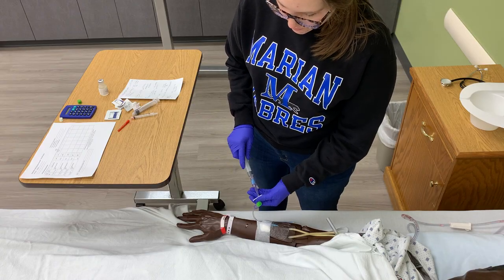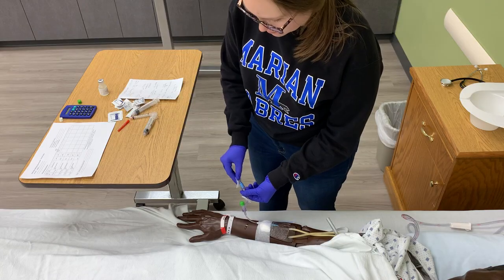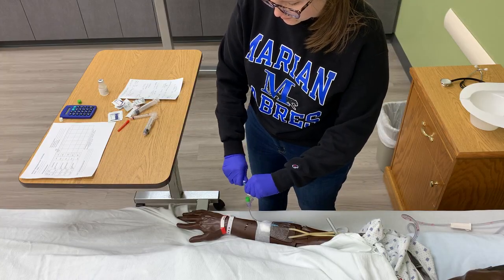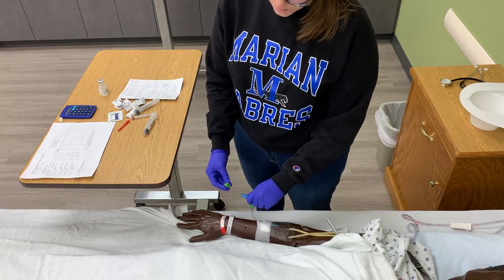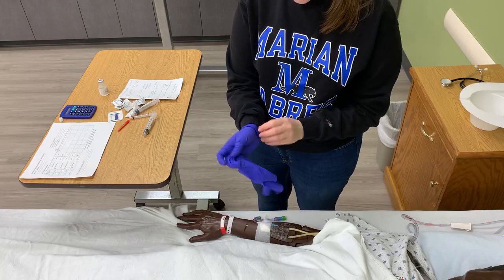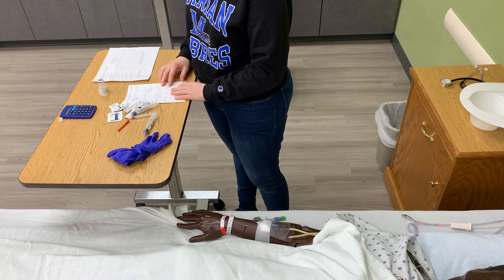Alright, so now I'm done. I'm going to clamp this, disconnect our syringe. We're going to wipe this off one more time. Alright, and then we'll say that this was a new swab cap, so then I'm going to peel off the label and attach that to my clave. Alright. So I can take my gloves off, dispose of my equipment, and then we're going to document that we gave the furosemide. So I'd write that down here, the time and initial, and put my signature down here.